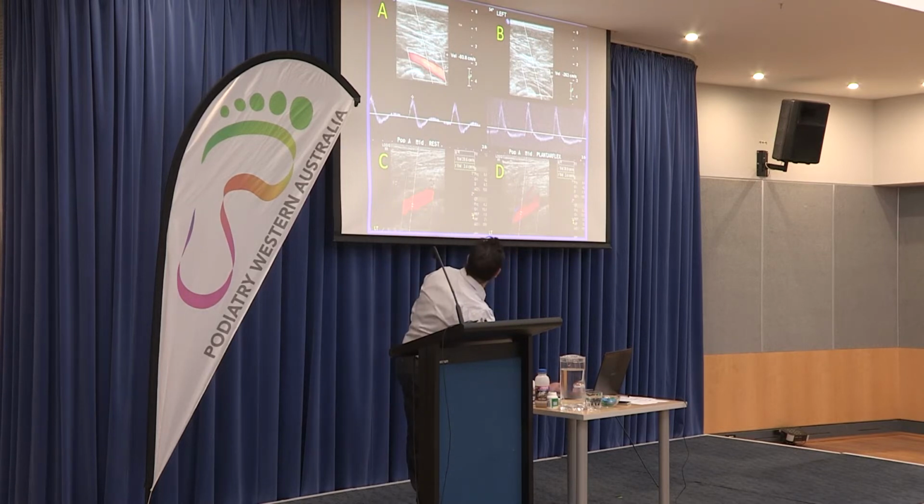So the top 2 images are non-exercise and with exercise in the popliteal artery, and then this is after treatment, this is at rest, and then this is with plantar flexion exercise. You can see this is still narrower than that, but it's much improved. And if you look, the maximum velocity hasn't actually changed that much.